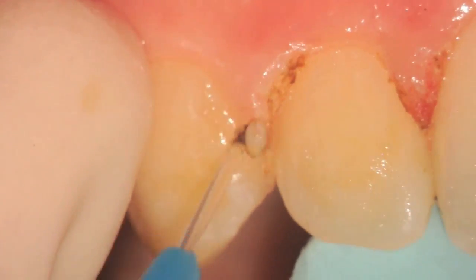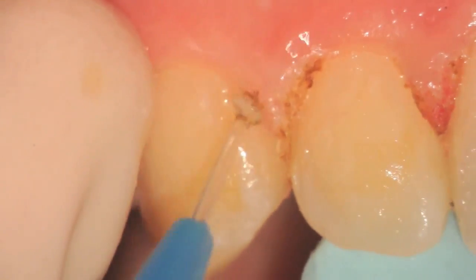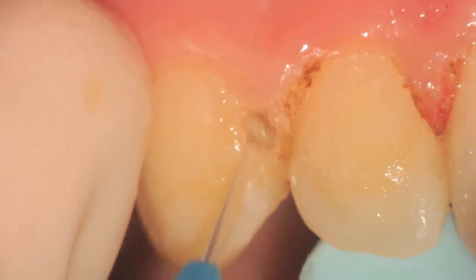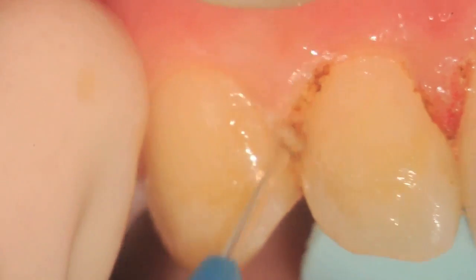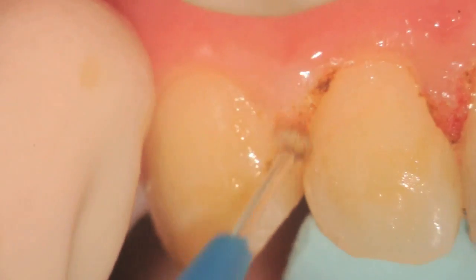The patient has been out of brackets now for a little over a couple of weeks and you can see the tissue has not resolved on its own. It needs to be refined before final retainers are fabricated after the positioner is completed.